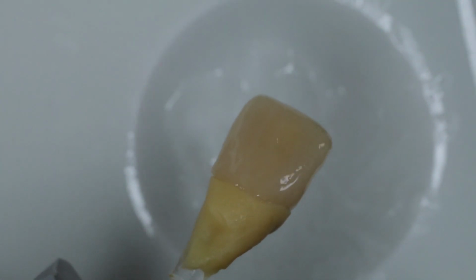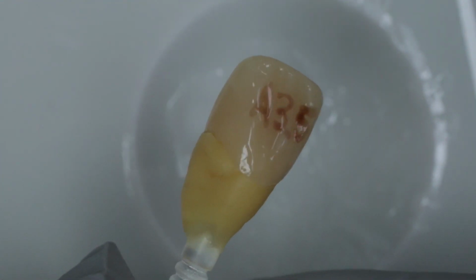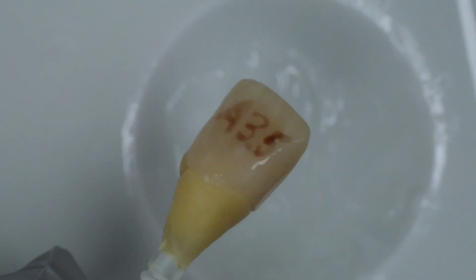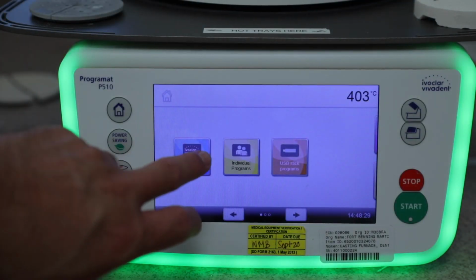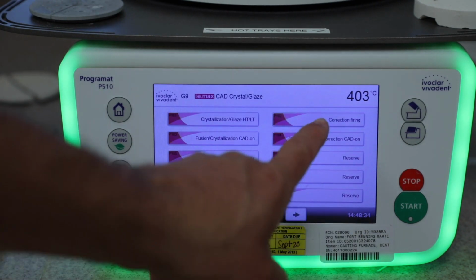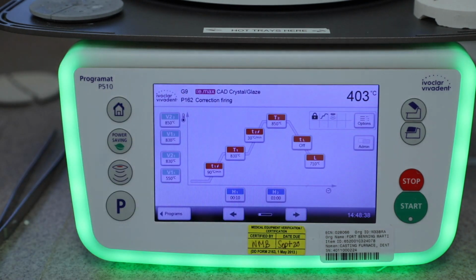All right, so that looks pretty good. Happy with that. So now what we're going to do is we're going to throw this into the oven and do a correction firing. All right, for this setting, we're going to go back to Ivoclar Programs, CAD Crystal Glaze, and we're going to do a correction firing since we're doing a glaze firing only.